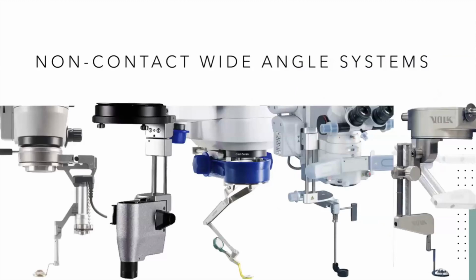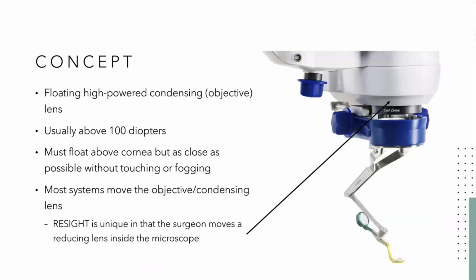So if we go back here, most of these other systems, if you go to the very bottom of the image where the lenses are floating, that's how you control the view and the focus, by moving that lens. The Zeiss ReSight system does not involve movement of that lens. That's fixed, actually. That arm that you see coming down doesn't change the distance of that lens from the microscope.